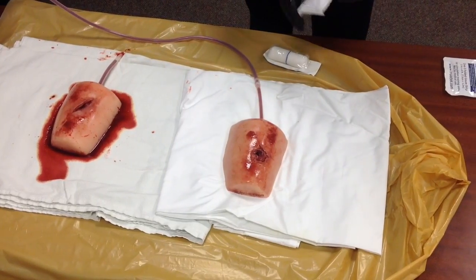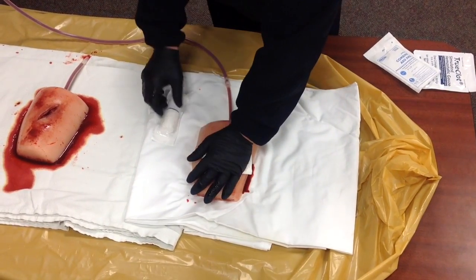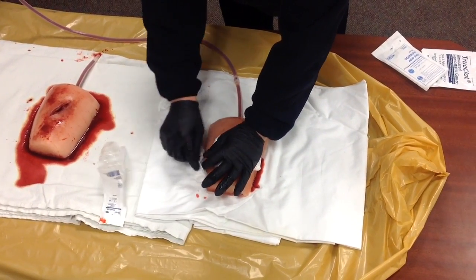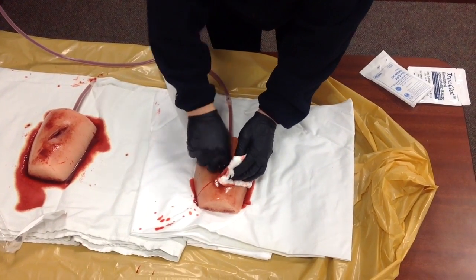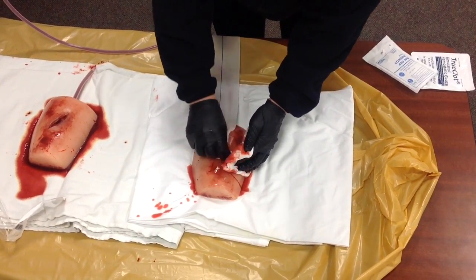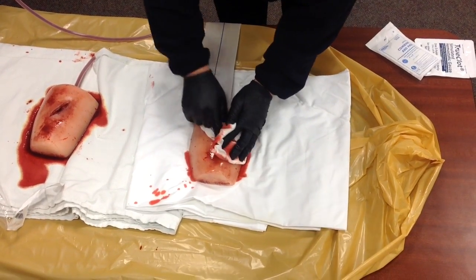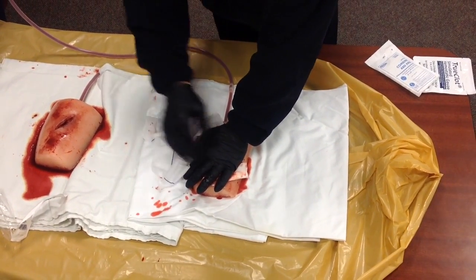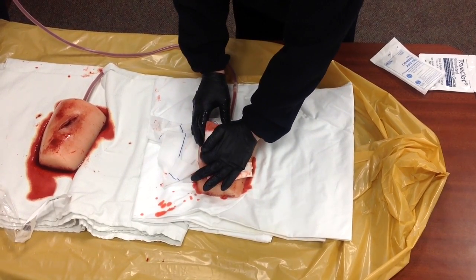This particular training device represents a large gunshot wound — you can see it has a large cavity. Start with direct pressure. Because of the size of the cavity and the flow, we know it's arterial in nature. Roll out the gauze and fill the cavity, continuing to put the roller gauze in as you did before. When the cavity is nearly full, you'll notice you can fit less and less gauze in each time — at that point, stop. Apply direct pressure and see if the bleeding stops. You should be able to control the bleeding this way.